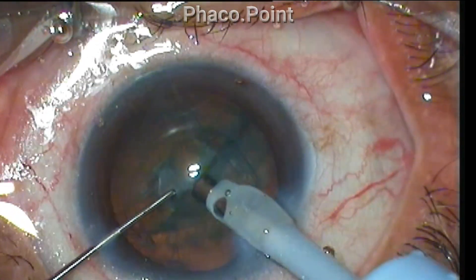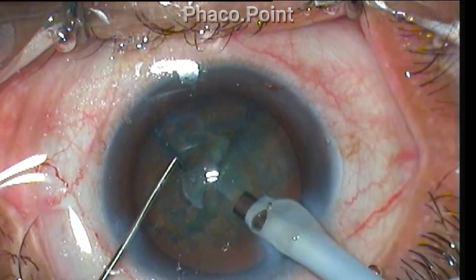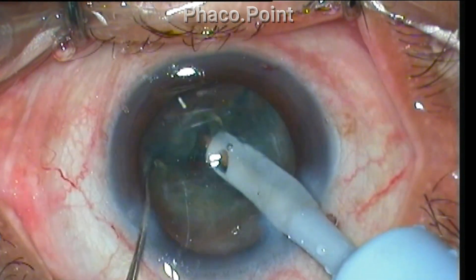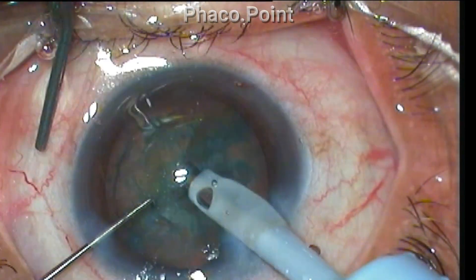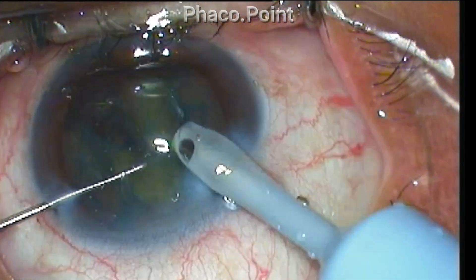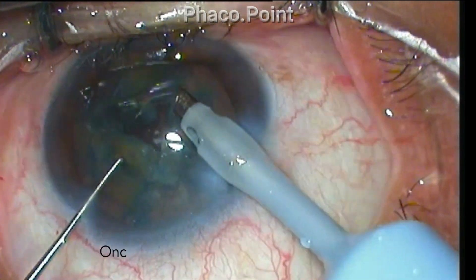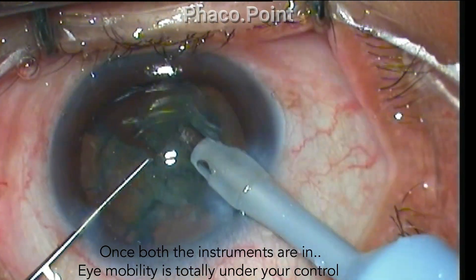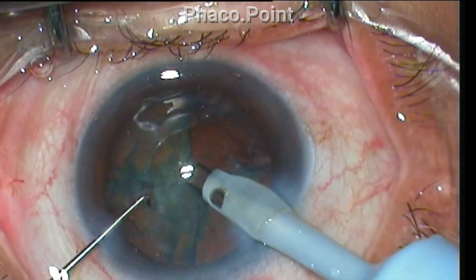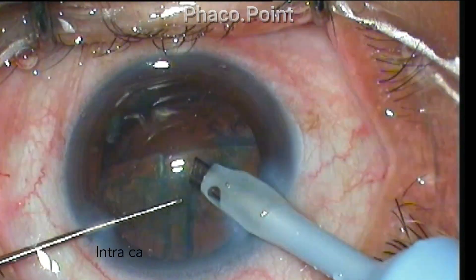The technique of nucleus disassembly is up to you — divide and conquer, stop and chop, horizontal chop, or direct chop; it does not matter. In this case I am using the direct chop technique on a dense nuclear sclerotic cataract. Pooling BSS is being aspirated with the cannula. Remember that once both instruments are inside the eye, mobility is totally under your control. Eyeball fixation is most critical only during the initial stages: incision creation, capsulorhexis, and hydrodissection.